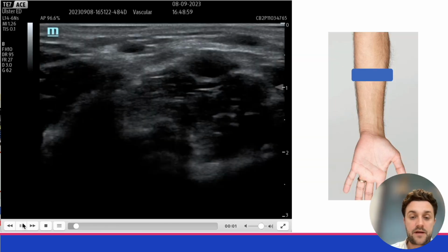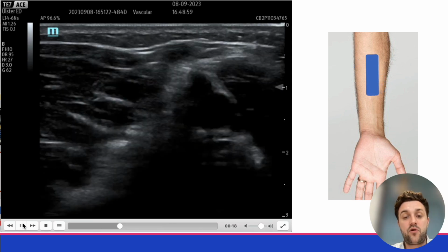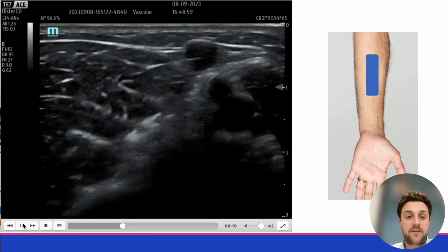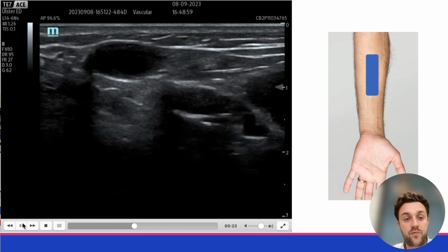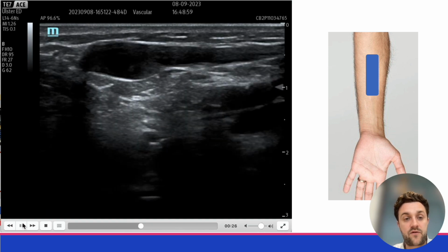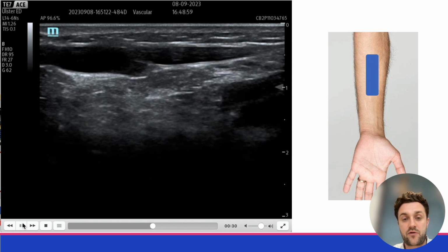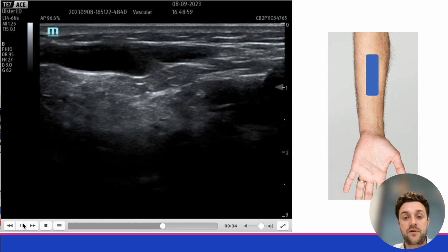The other way that we can help find the direction of the vein, if we're struggling to find it with the other way, is by rotating the probe slowly 90 degrees, as you could see there on the arm. And what should happen if you keep the vein in the middle of the screen at all times is that the vein will start to open out. And once it's opened out fully across the screen, you can then look at your probe to see which direction the probe is going, in this case straight up and down the middle of the arm, and then you'll know that that vein goes in that direction, and then you can slide back into our transverse way.